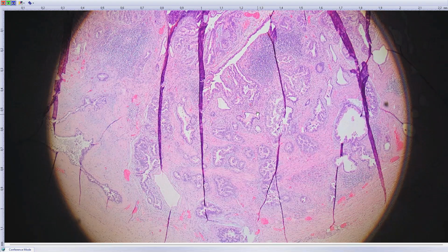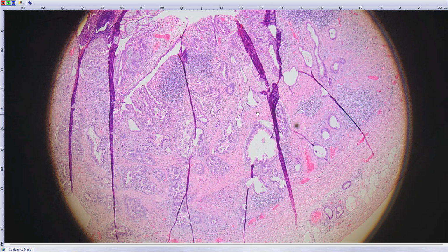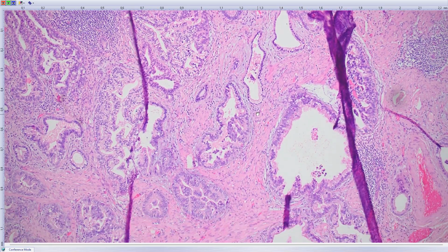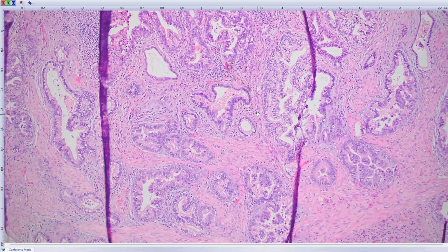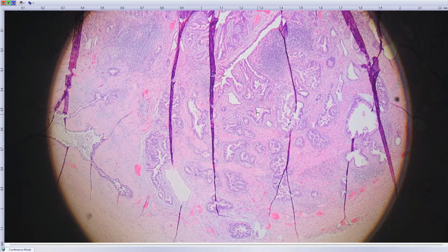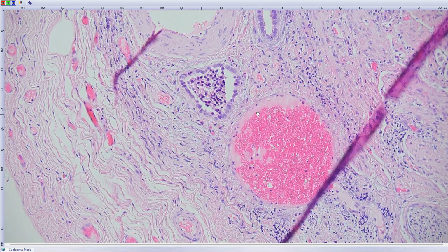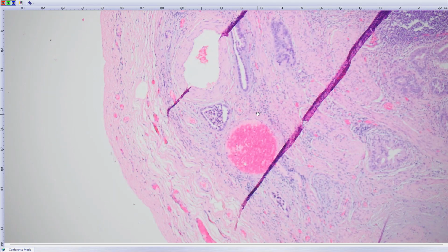search for carcinoma. So sometimes this dysplastic epithelium goes down into the Rokitansky-Aschoff sinuses, and you cannot tell whether it's invasive or not. But in this particular case, these glands are so haphazard, and we have these atypical looking very small glands which are not Rokitansky-Aschoff sinuses. So I believe it's invasive carcinoma already.